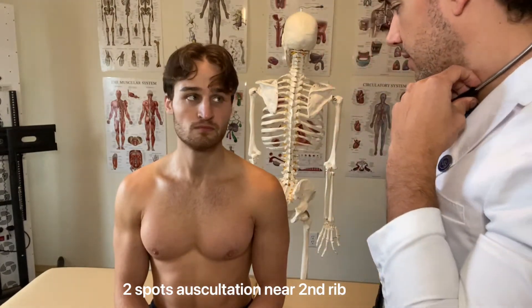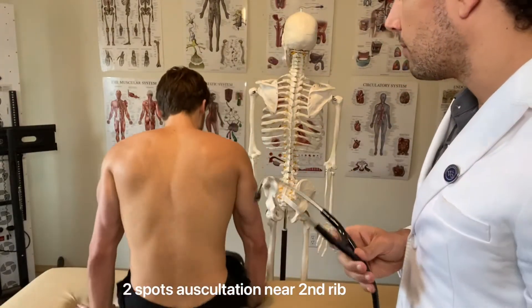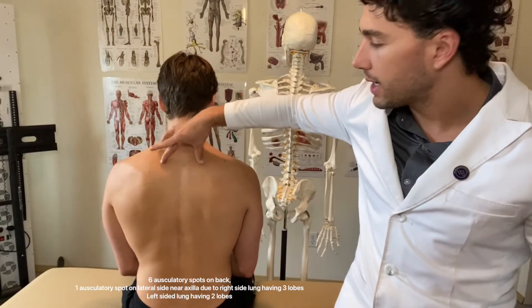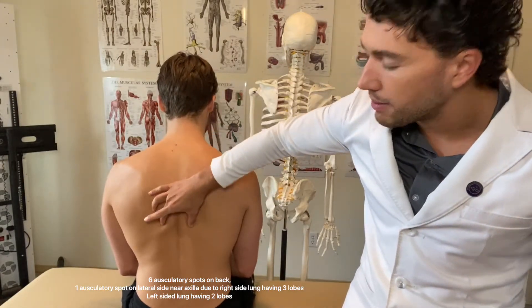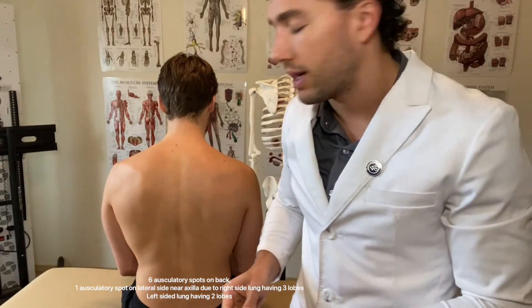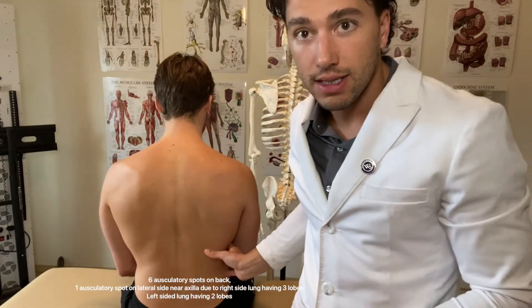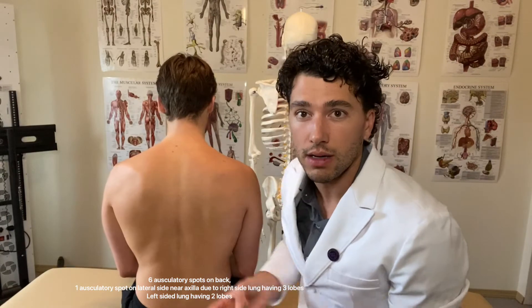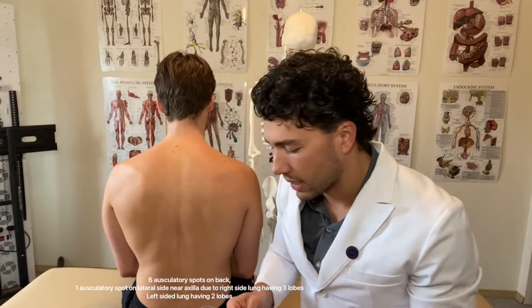Would you be able to flip on over, sir? On the backside, I might go up towards the upper spine, mid spine, and then mid to lower spine — around six points. Then we're going to go to the right side for about the mid side of the rib for the right lobe of the lung, because the lung has three lobes on the right and two on the left.